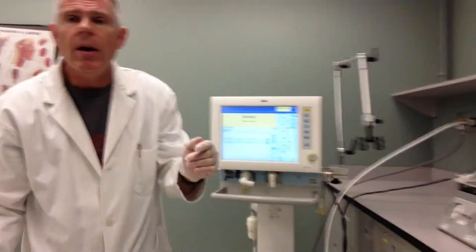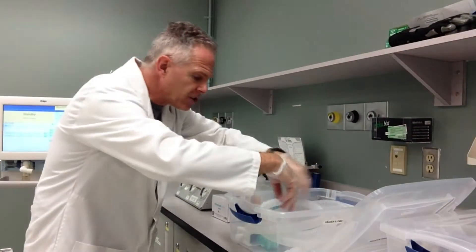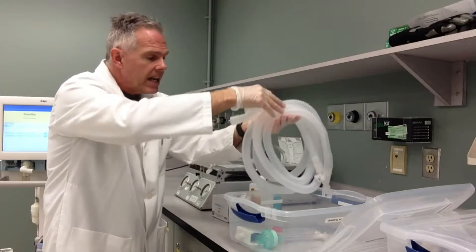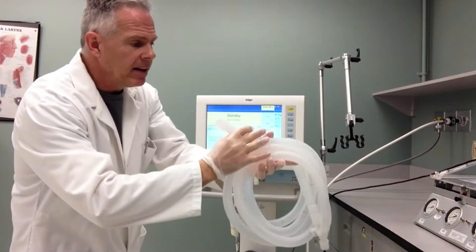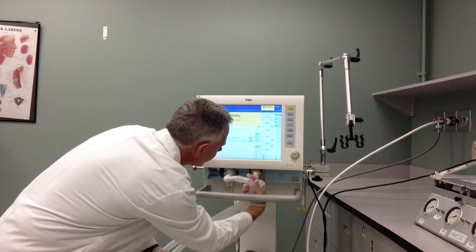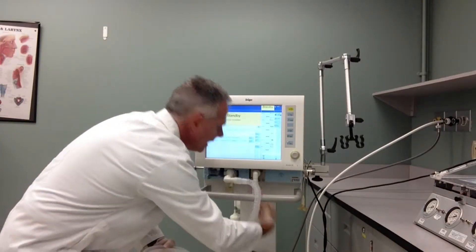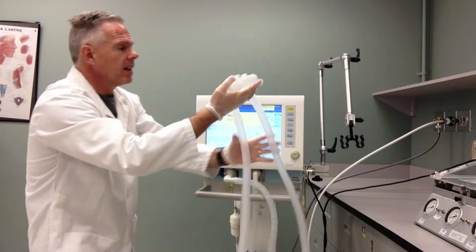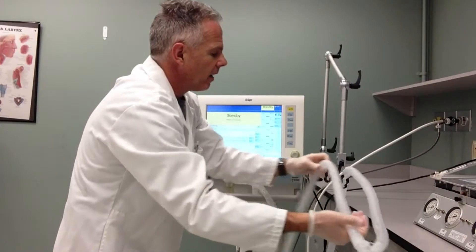I'm still pretty clean right now because I've only touched those components that came right with the circuit. I'm going to pick up my circuit here out of the container, keeping it clean, making sure I don't touch anything. Come over to the ventilator and I'm going to attach the exhalation valve — you can just put that right on there. I'm going to attach the inspiratory side of the circuit as well. You notice I haven't touched anything but the circuit, so I'm going to keep this clean. I'll bring these over and drape them right over our little stand here that we've got for the ventilator.